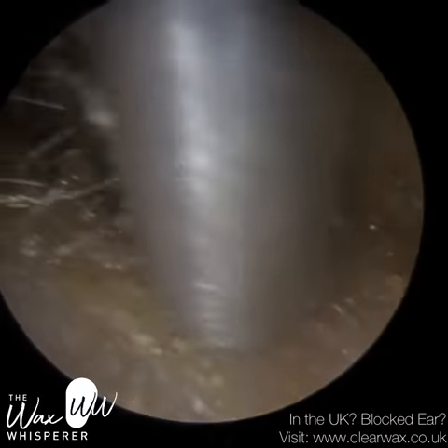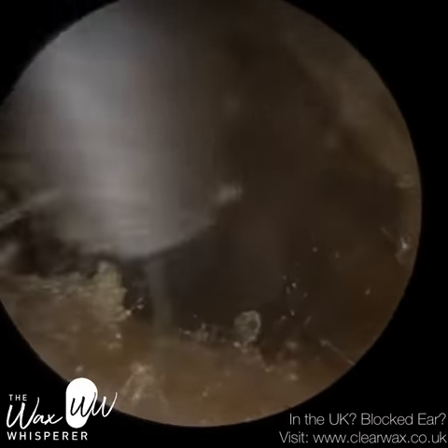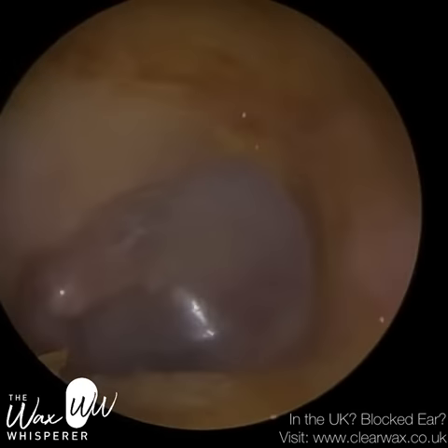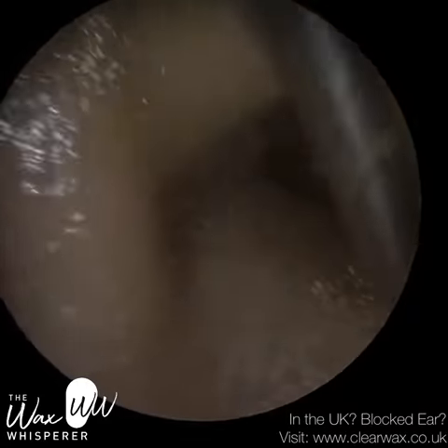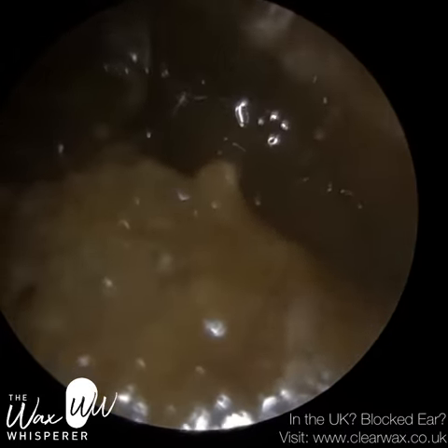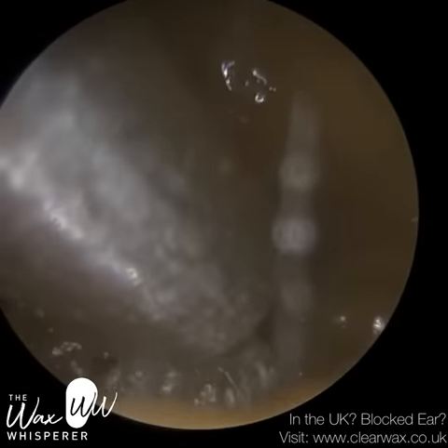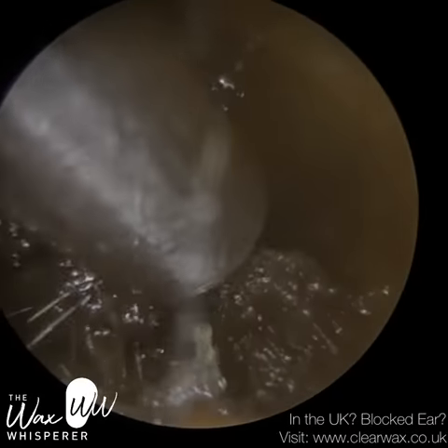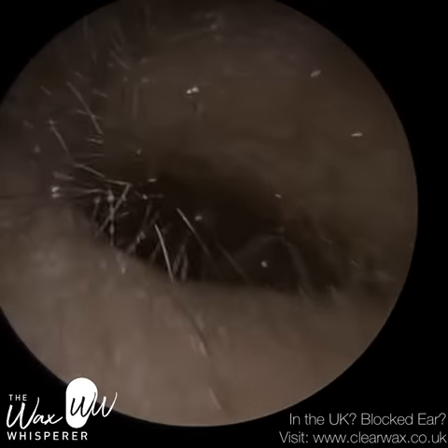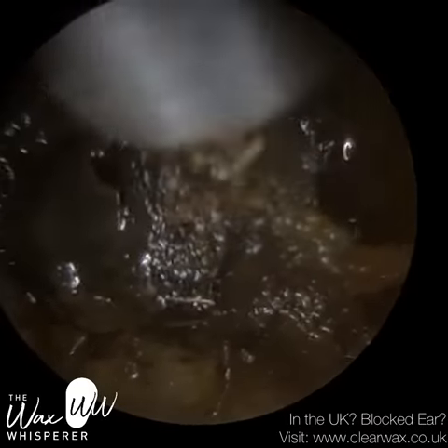Patient two — we've just cleaned the left ear. There is a bit of wet wax lining the canal wall but I'm not too interested in removing that, as the patient just needed the blockage cleared. A bit of wax is actually very healthy. Earwax provides both a physical and chemical barrier: the physical barrier protects the delicate skin lining the ear canal — like a thin film — against bacteria, fungi, and viruses. It also acts as a chemical barrier because earwax is slightly acidic, which helps inhibit certain bacterial and fungal growth. So a bit of earwax is actually good for us.